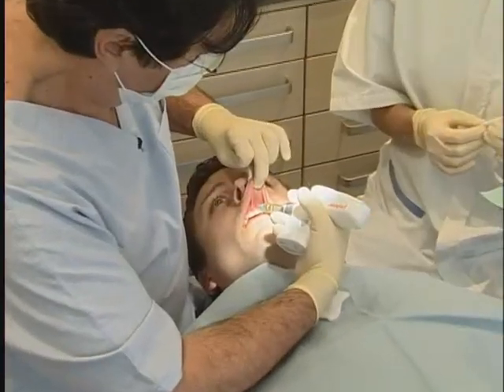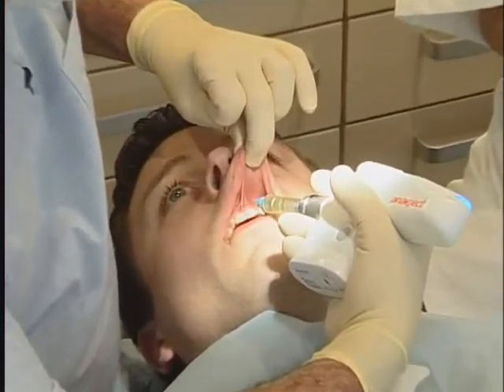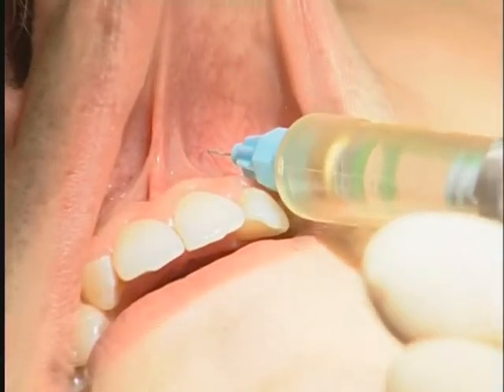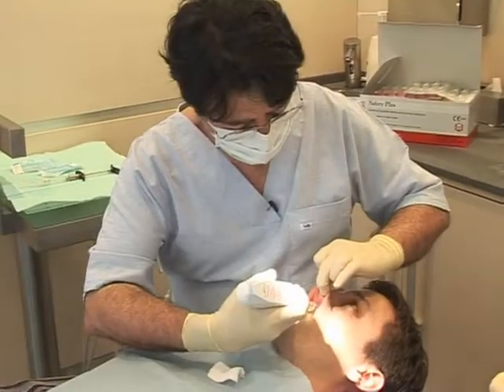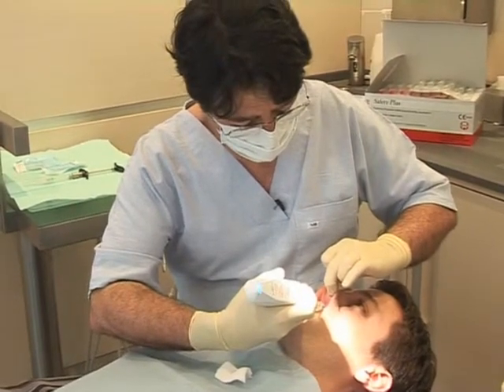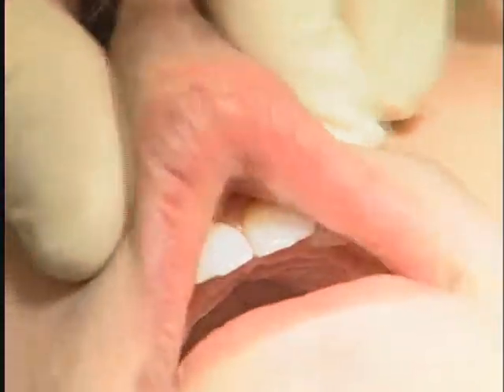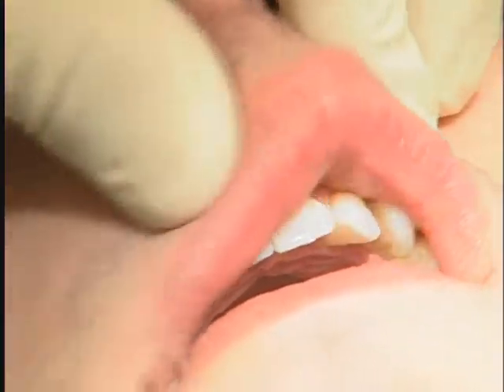If the anesthesia fails, the first option is to inject the mucobuccal fold on the other side of the labial frenum. Consider anesthesia of the nasopalatine nerves in the incisor canal if pain persists.